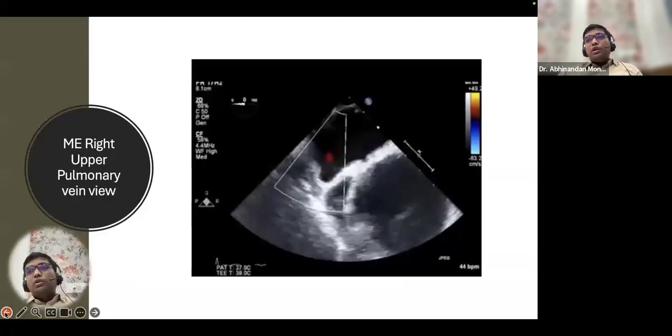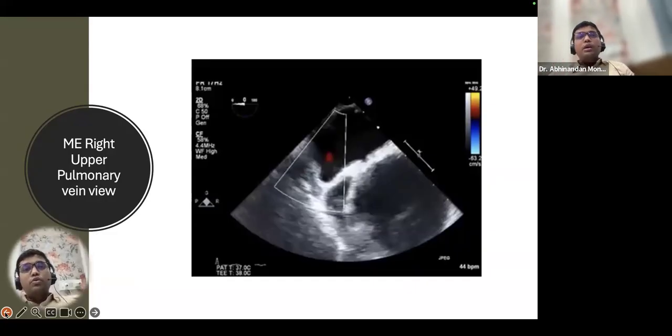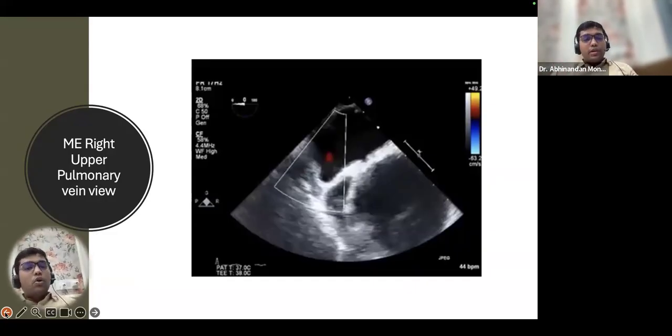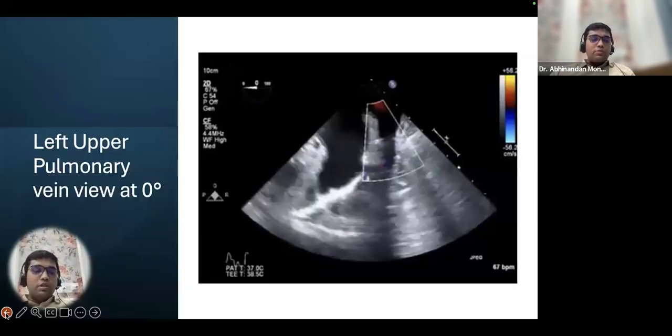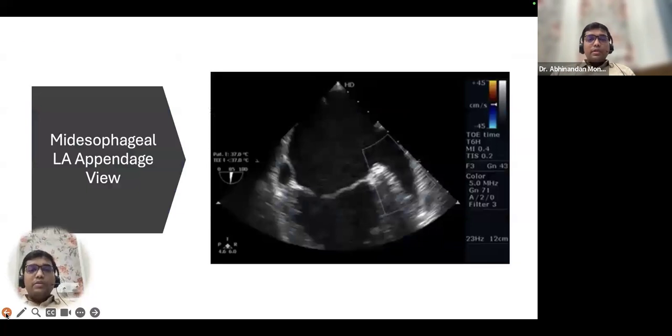Second, if you trace it down, there will be a junction of your hepatic vein draining into that IVC, but there will be no hepatic vein draining into your coronary sinus. So the coronary sinus is usually much smaller, unless it is hugely dilated due to other congenital pathology. Otherwise, the coronary sinus has a much smaller diameter than your IVC.